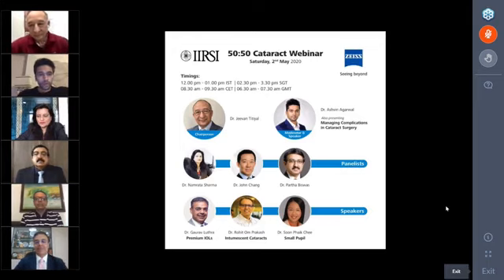Before I move on to Dr. Rohit's talk, one last question to Dr. Namrata. How many of the regular patients, Doc, do you do topography on? Because in regular patients, even if you don't have a premium, how do we know if there's an amount of toricity to the cornea that we have to combat pre-op? Do you do topography in regular patients as well, or no?